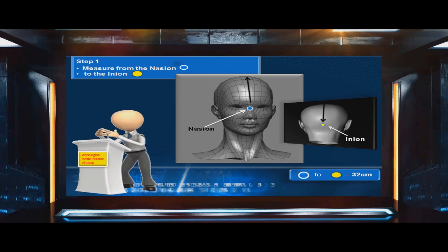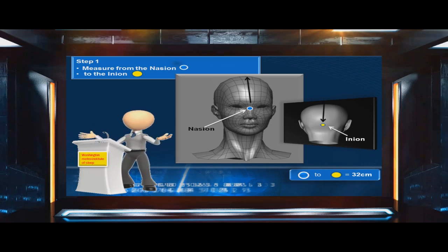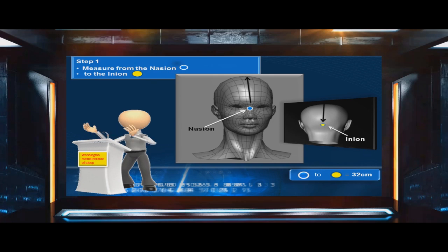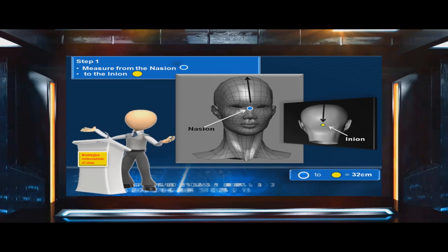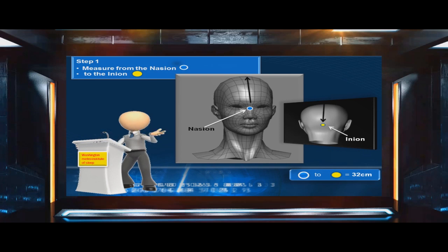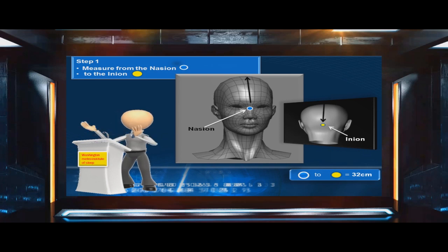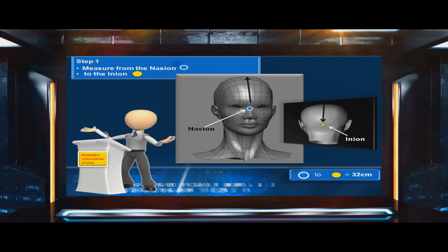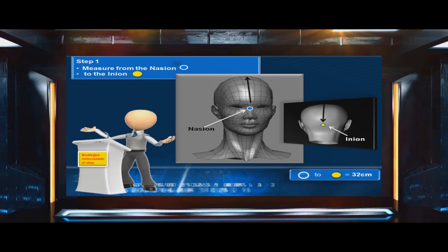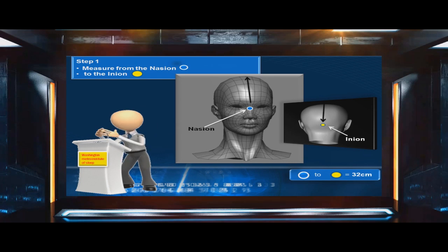Step 1: Measure from the nasion to the inion. The nasion is located in the center of the face, right between the eyes. The inion is located at the back of the skull. If you have the patient lean their head forward, you will feel the inion bone location. In this example, the nasion to the inion equals 32 centimeters.